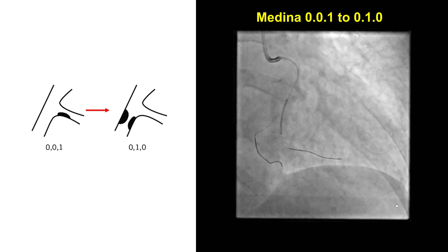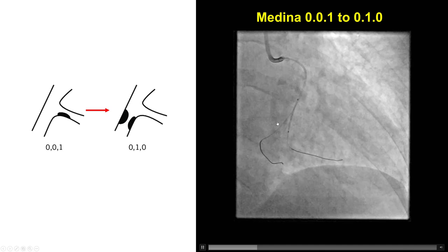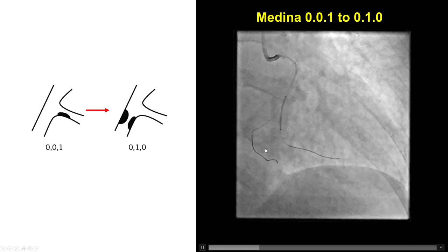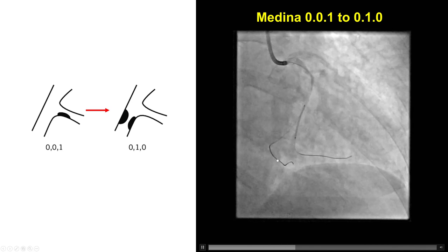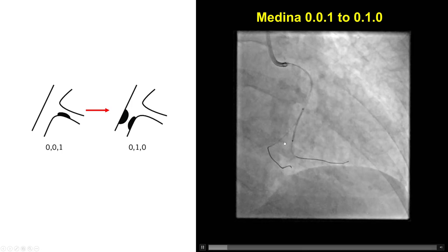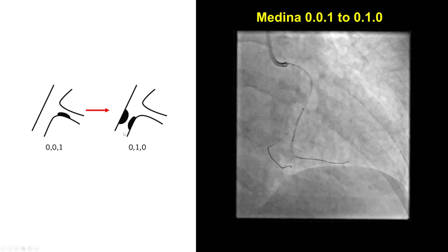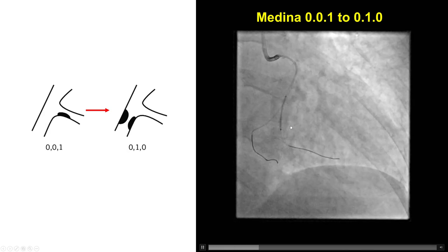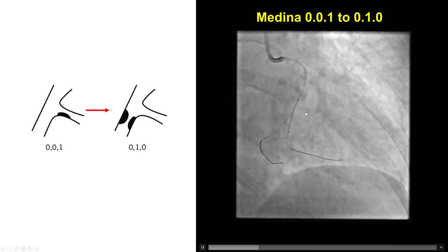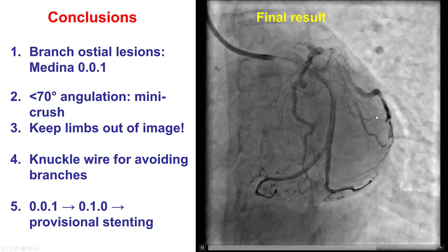We finally changed our plans. Instead of using the mini-crush technique, we reconsidered. This was a Medina 0-0-1 side branch bifurcation, but looking at the size of the OM2 versus the distal circumflex, the OM2 is actually larger than the distal circumflex. So one can argue that the main vessel is the mid-circumflex going into the OM2, and the distal circ is actually the branch. Thinking in those terms, this becomes a 0-1-0 bifurcation, and provisional stenting is the best approach — which is exactly what we did. A 2.5 mm stent was deployed, followed by the proximal optimization technique, achieving a nice final result.